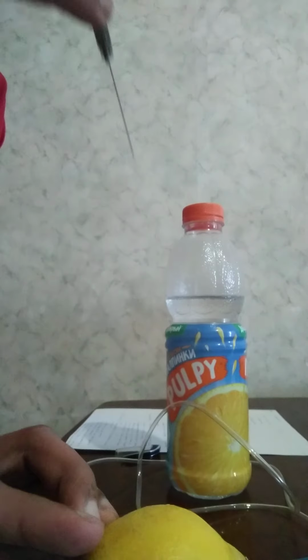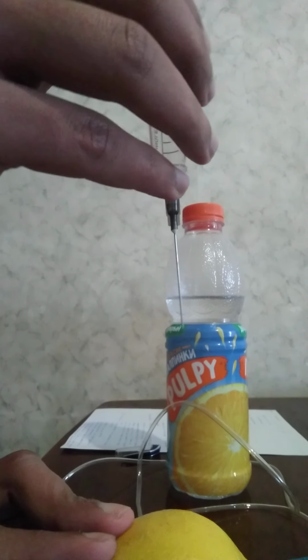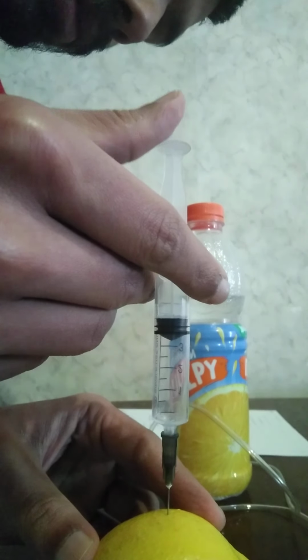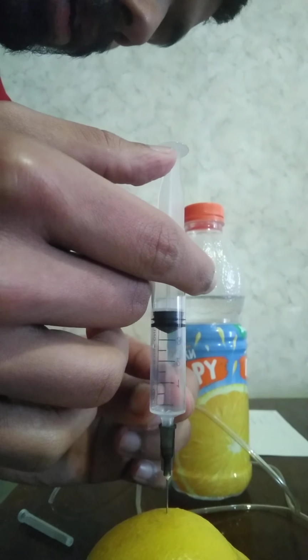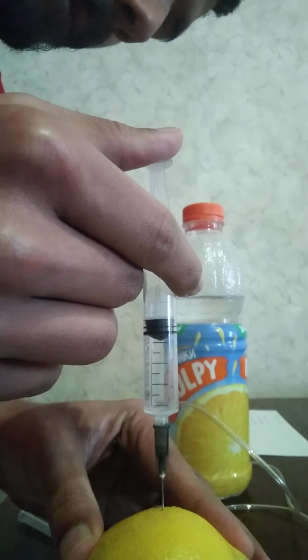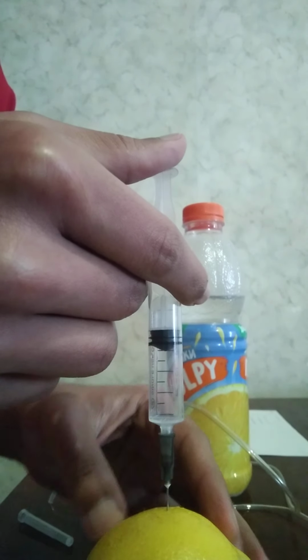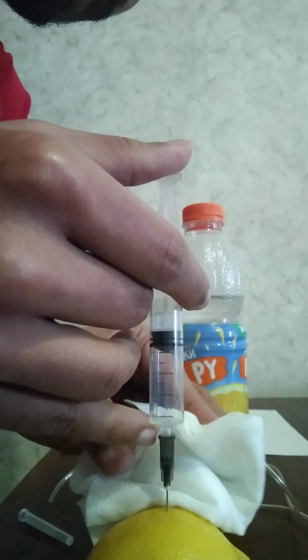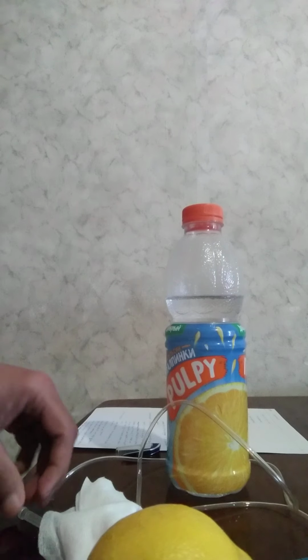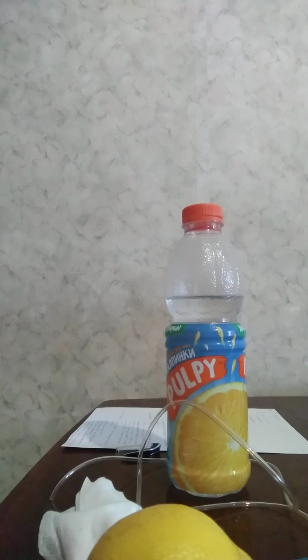And then remember that the injection site has been already cleaned. The needle is advanced at 90 degrees. It's advanced as fast as possible to avoid pain. As you can see, I have left 1/3 of the needle outside. Once it's inside the muscle, we may pull back on the plunger to see if it has hit any capillary or vein. If blood is negative, we may advance the solution. After the solution has been advanced, we may now place a cotton and withdraw the needle. Intramuscular injections are given for quick absorption of delivery material.